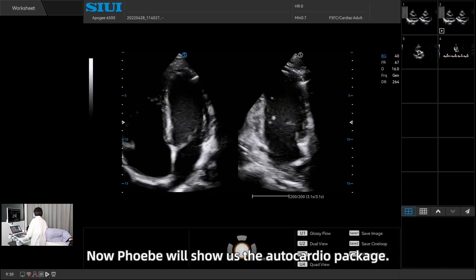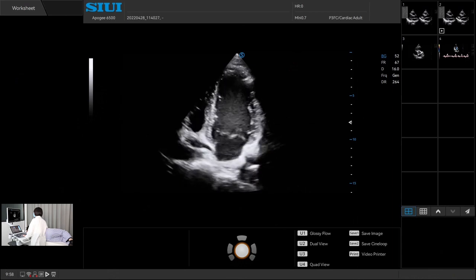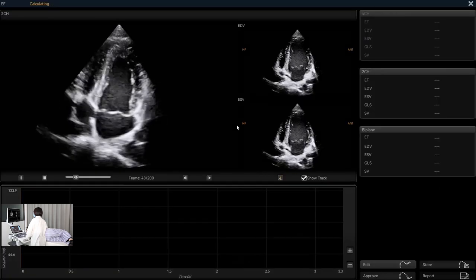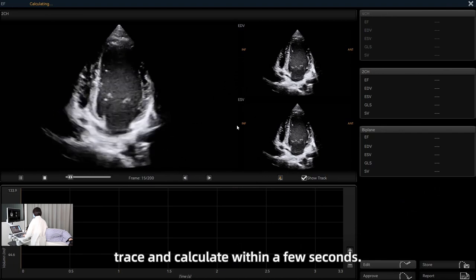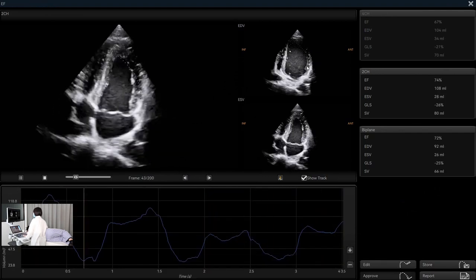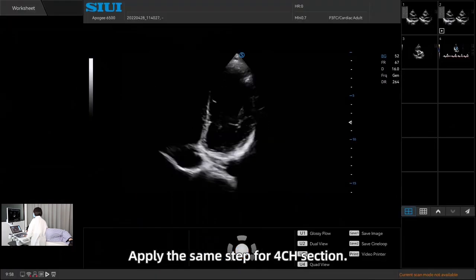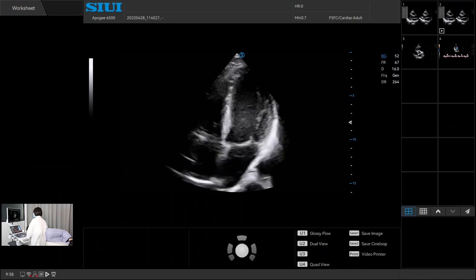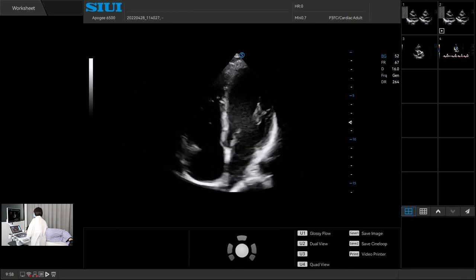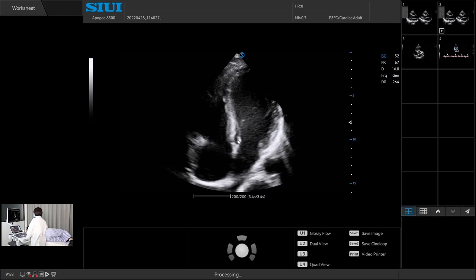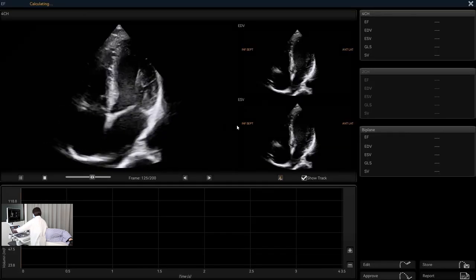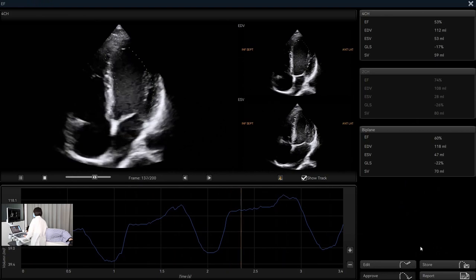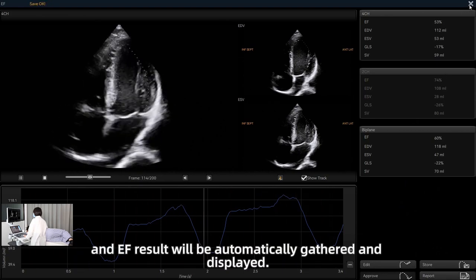Now Phoebe will show us the AutoCardio package. Remain in the apical 2 chamber section and enter AutoEF. The system will trace and calculate within a few seconds. Apply the same step for the 4 chamber section. Again the system will calculate itself, and the EF result will be automatically gathered and displayed.